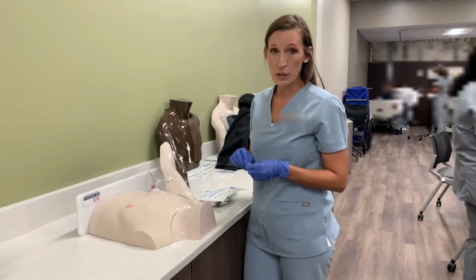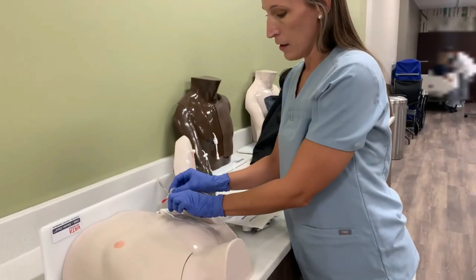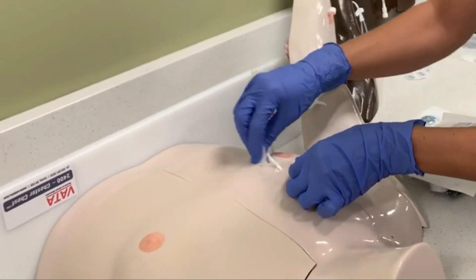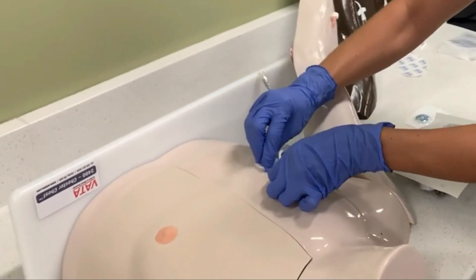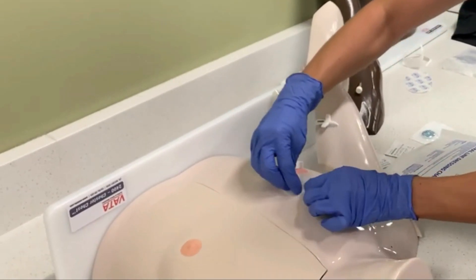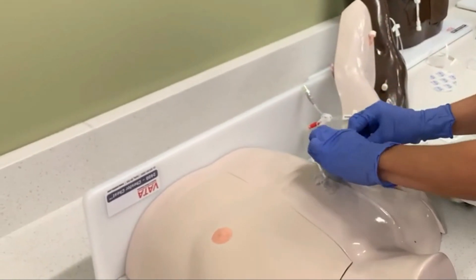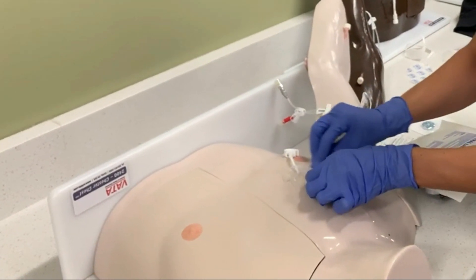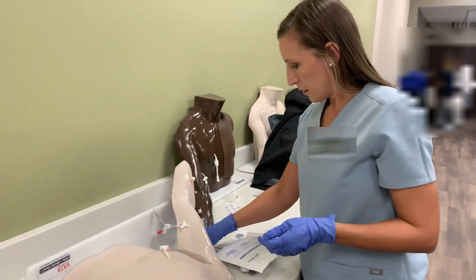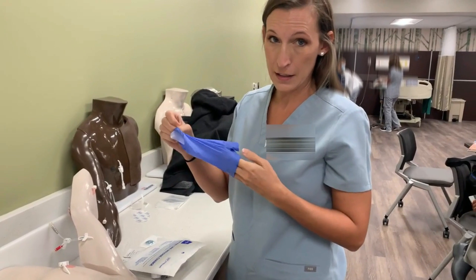The first thing we're going to do is take off the old dressing. Make sure you put gloves on, then take an alcohol pad and lift the corner, pulling to the center. You can use the alcohol pad to help degrade the adhesive, then pull it off. Take off the gloves inside out so your trash is on the inside of the gloves.